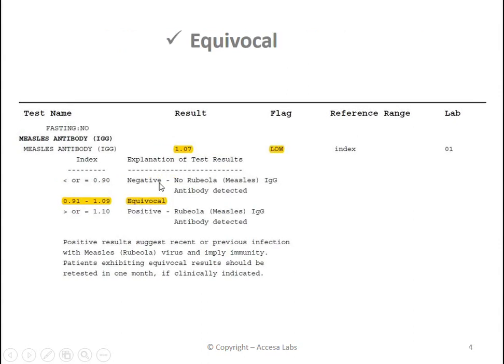Lastly, we will look at an equivocal result. Once again, we look for the numerical result under the result heading. You can find it here.